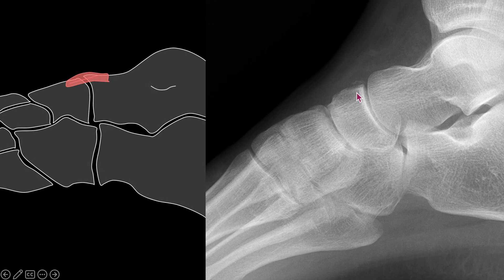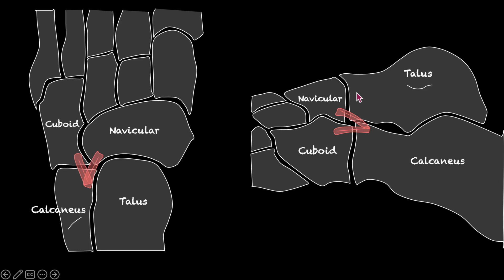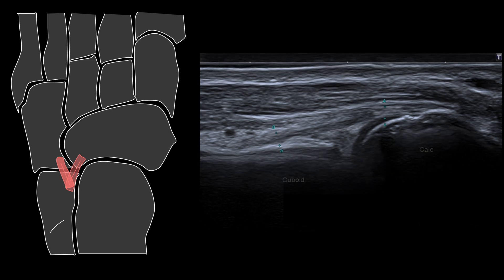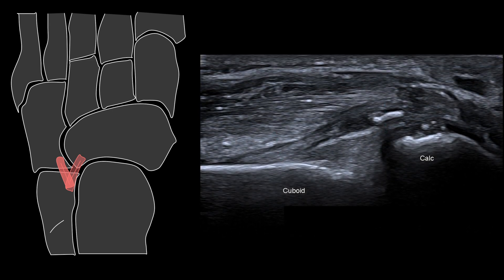The bifurcate ligament is the next most important ligament to assess in the Chopart complex. To identify this, I simply palpate the anterior tubercle of the calcaneus, which is such an important structure anatomically. From the anterior tubercle of the calcaneus, we simply align the probe with that of the cuboid to identify the calcaneo cuboid component of the bifurcate ligament. Here is an avulsion fracture of the anterior tubercle of the calcaneus — a common injury.